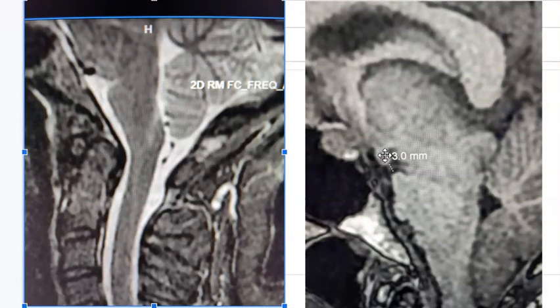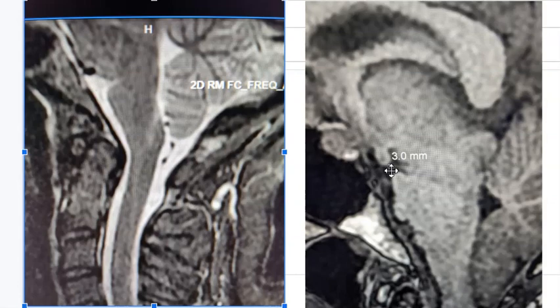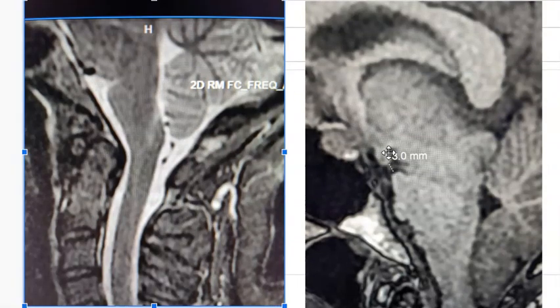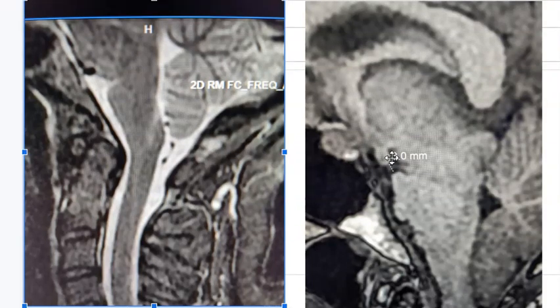We also see the mammillary body here and the pons, and the distance between these two is usually significantly greater than this. Instead, this is a narrow pontomammillary distance, and this is associated with intracranial hypotension.